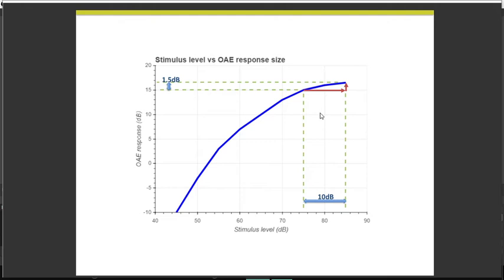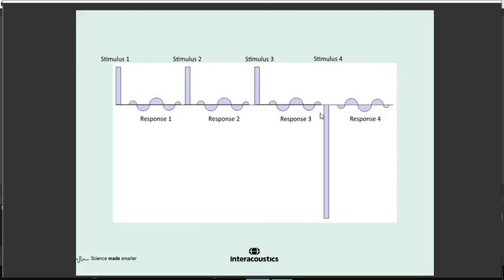That enables us to construct a stimulus paradigm, a sequence of stimuli, to specifically extract just that non-linear saturated response. We do that by, in this case, a set of 4 stimuli. Three of them are one size, and the fourth one is 3 times bigger.